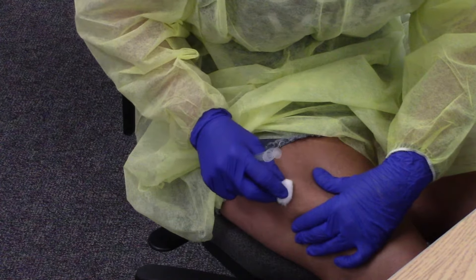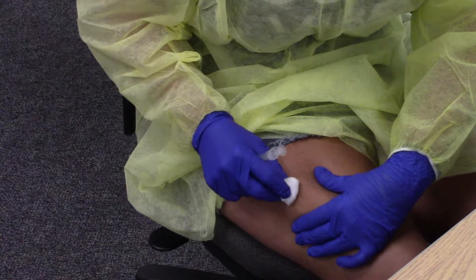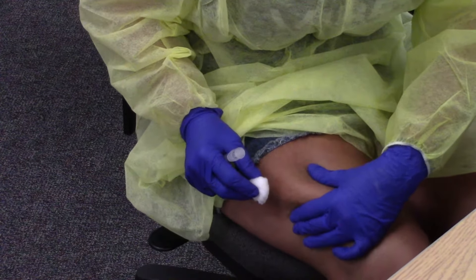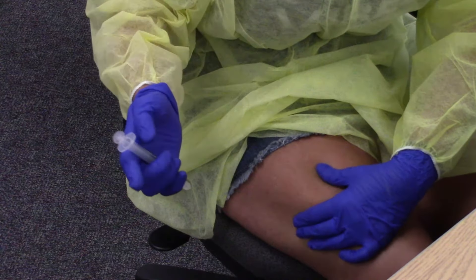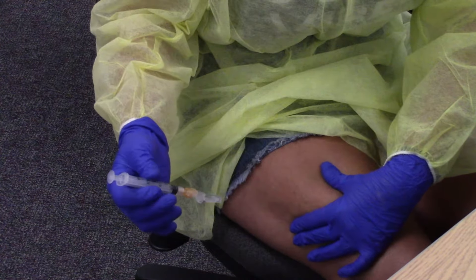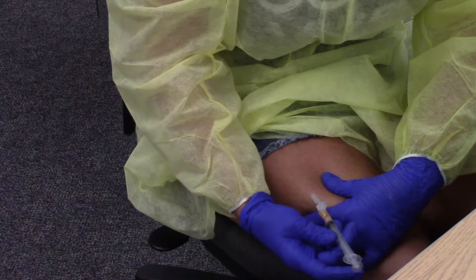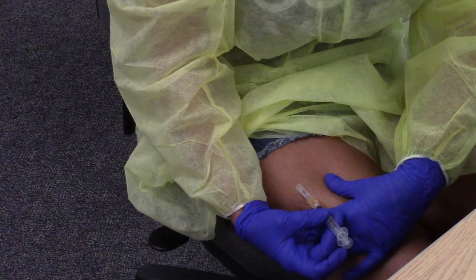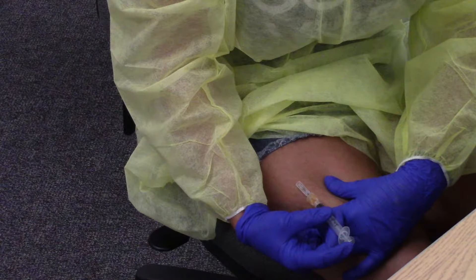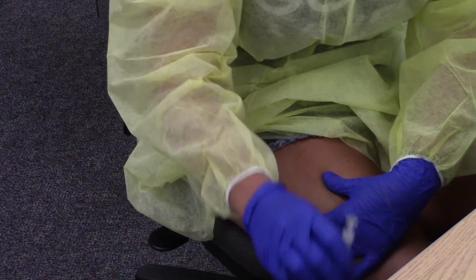We're going to do a sub-Q and an intramuscular on ourselves. For sub-Q, we're going to pinch up about an inch and clean it. If you're doing it on yourself, it's easier to go in at a 45-degree angle — go in at the 45, inject, come out, and put your safety on.